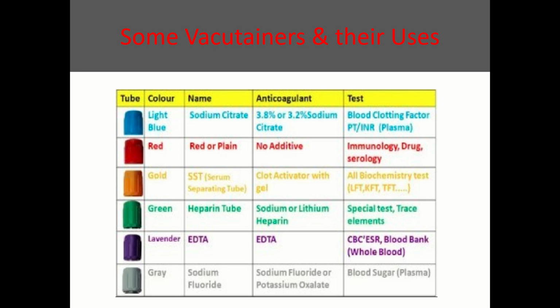Likewise, we send plasma for lipid profile, cholesterol, total proteins, albumin globulin ratio, and also glucose.